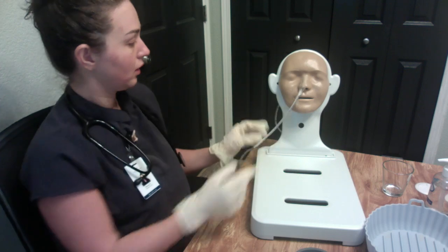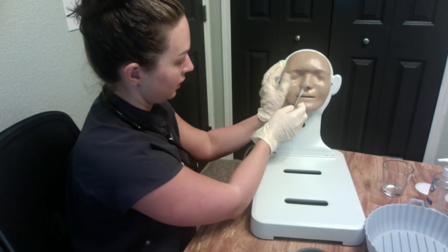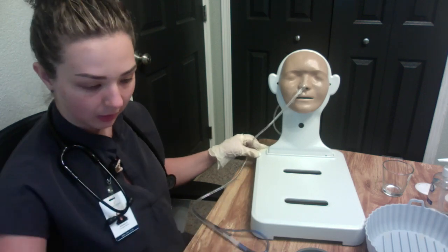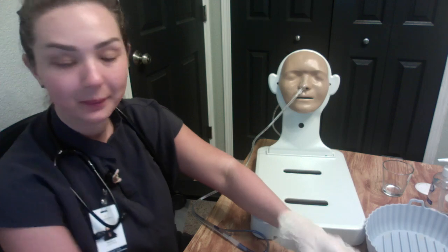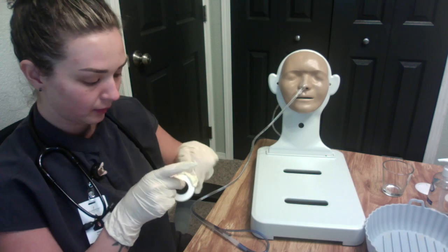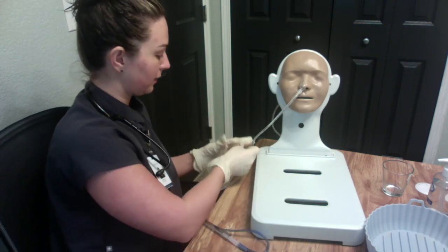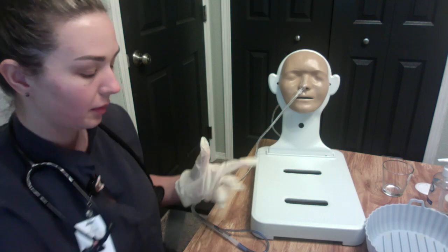Right, and then from there, I'm going to clip this to the patient's shirt. I don't have a safety pin or anything, so I'm just going to tape it. But ideally we would want to put that on the patient's shirt.